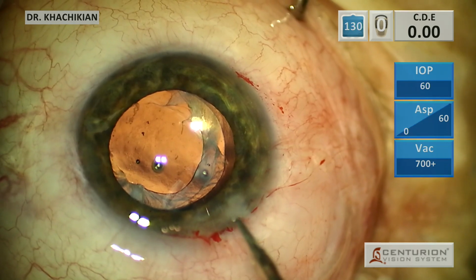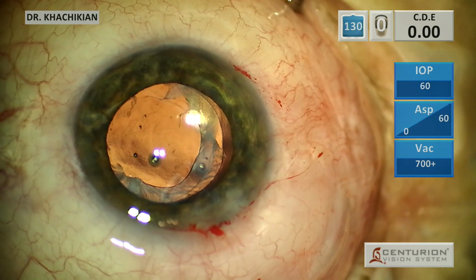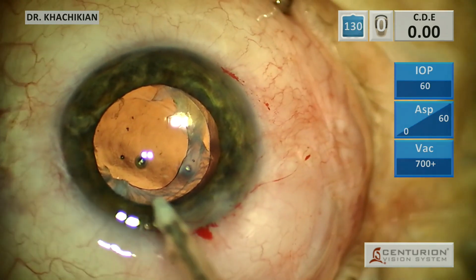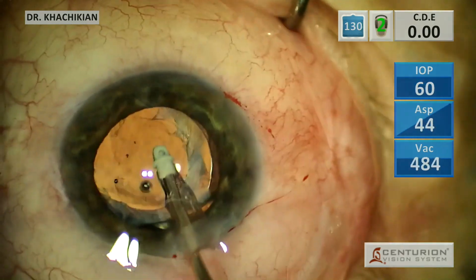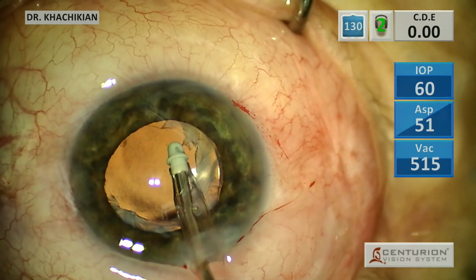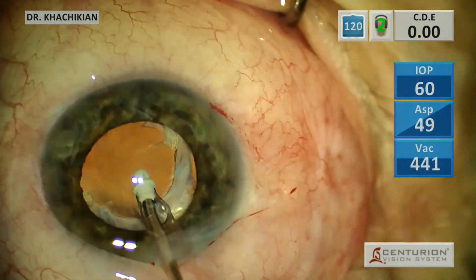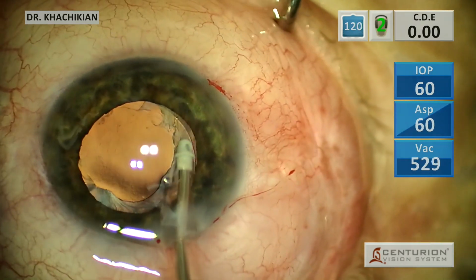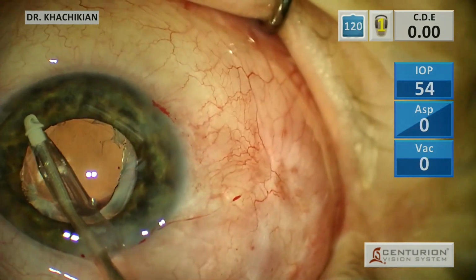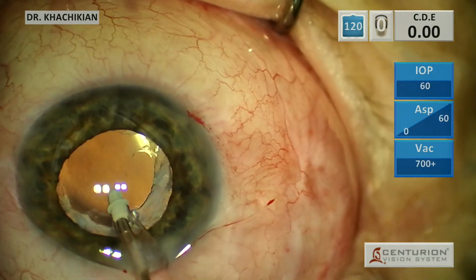So what we'll do is get back, finish up our IA, see what else we can get out of there, and seal up our incisions. I'm happy that we did not have to do an IOL exchange on this patient, because he's got additional capsular support already. We put a capsular tension ring in. I like to keep the lens in the bag if we can, rather than put one in the sulcus.